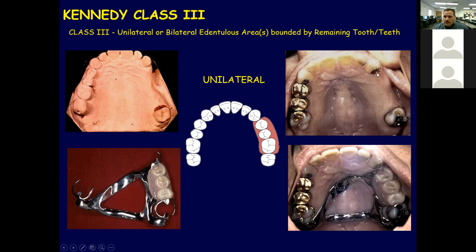And you know what this is? Shadir, what do you think of this? This one? What's the question? Oh, look, sometimes the dentist, because we're going to put a metal here. Can you see this metal thing? Yeah, that supports the pressure. So sometimes food gets stuck underneath this metal and causes decay of the tooth. So sometimes the dentist will make a filling here to prevent decay. And sometimes they make a crown to cover this and protect this area, especially if the tooth is small.